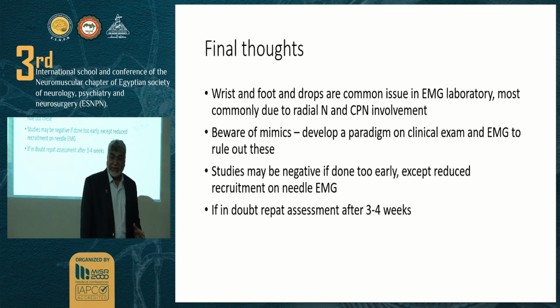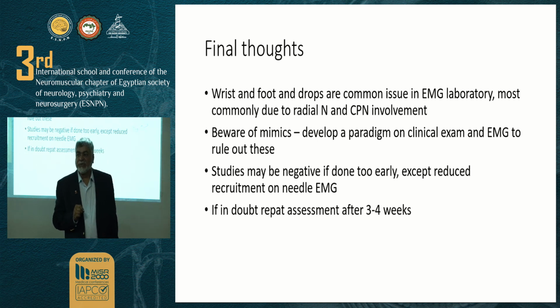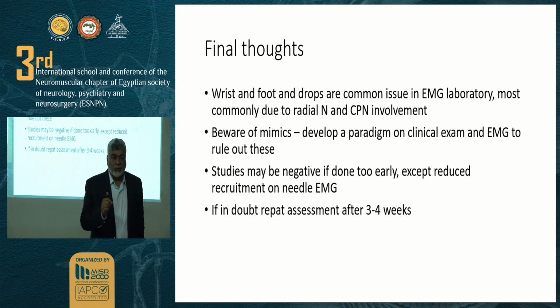The Wallerian degeneration takes several days to come in. If you see a patient with a foot drop, and you say, oh, maybe they had a stroke or something, the thing which a stroke won't do is this: the recruitment pattern in central lesions is normal. It's not reduced. Even in acute neuropathy, if you look at the recruitment pattern, because of whatever pathology, they won't be able to recruit motor units. That's why they're weak.